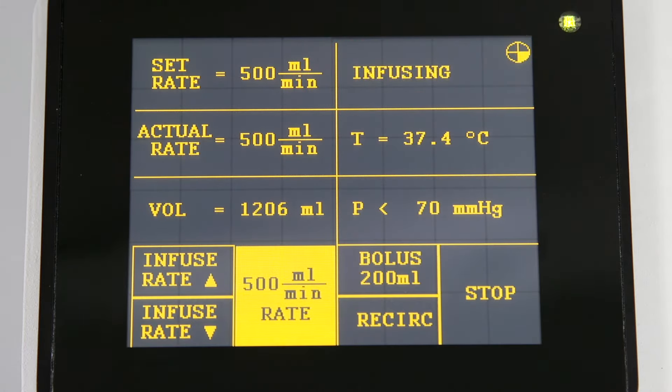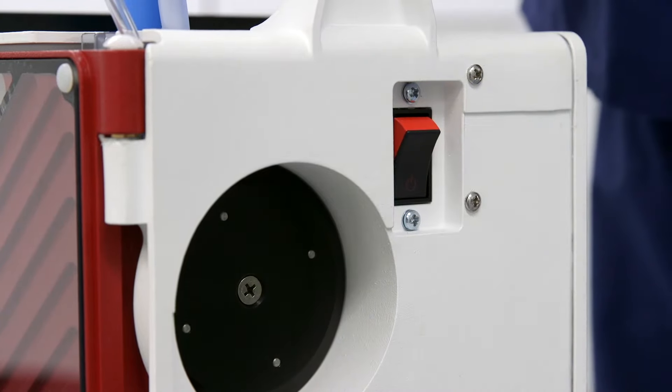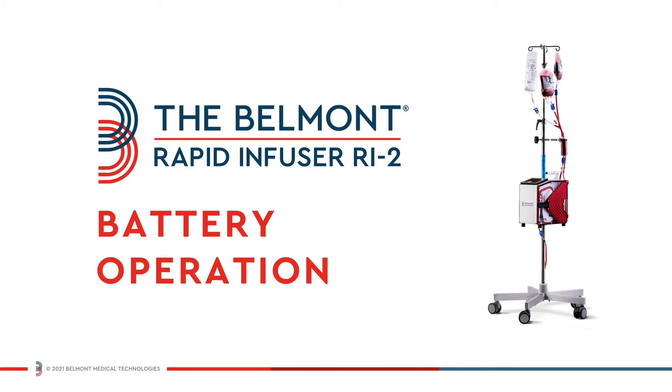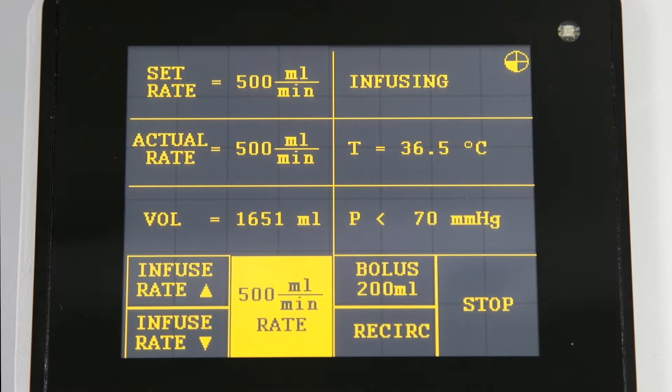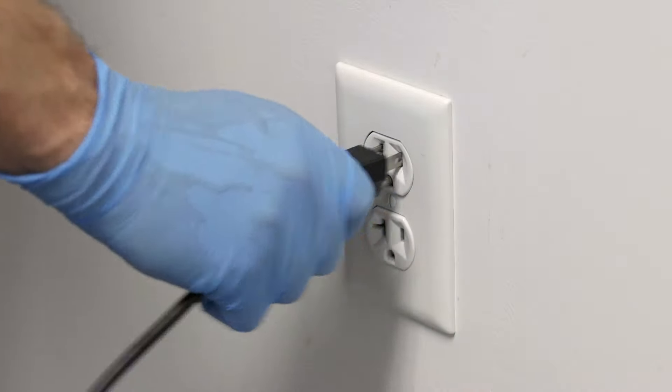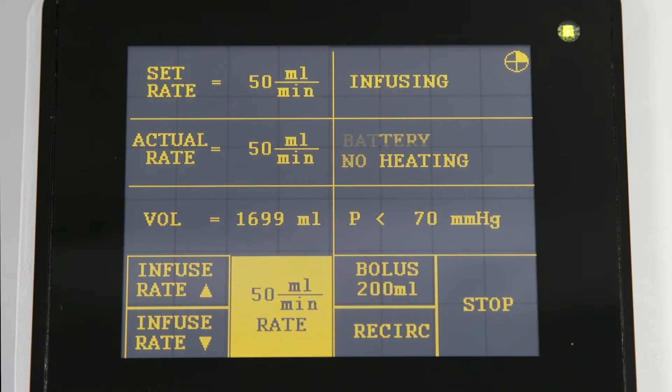At the end of the procedure, be sure to disconnect from the patient and power down by turning off the power switch. If there is a loss of power, if the machine is accidentally unplugged, or if the patient needs to be transported between units, the Belmont Rapid Infuser RI2 will automatically switch to battery power.